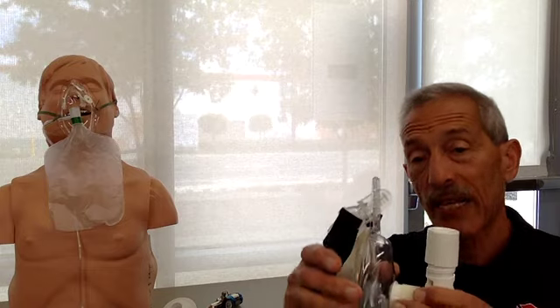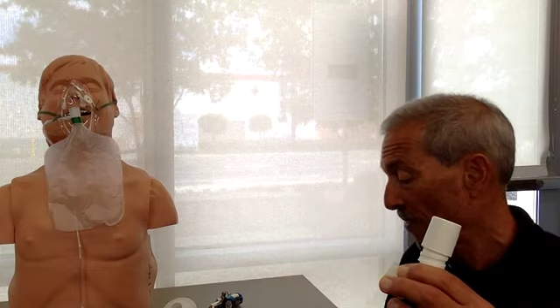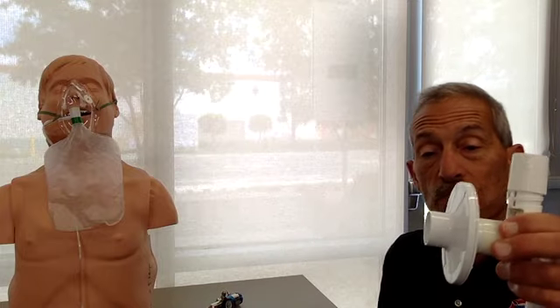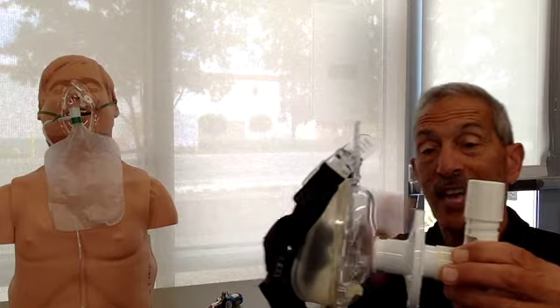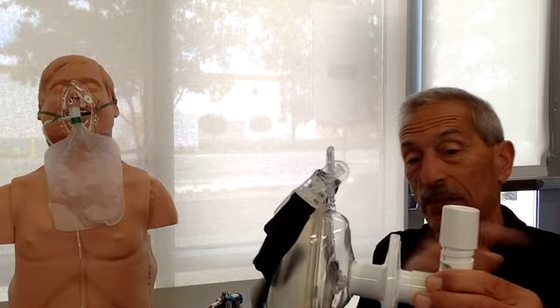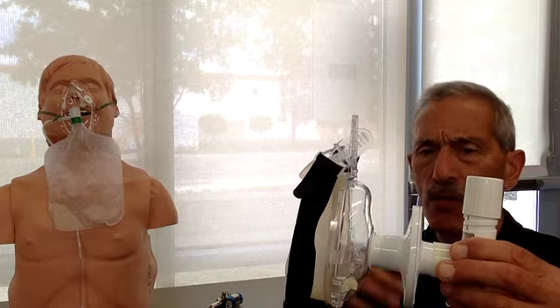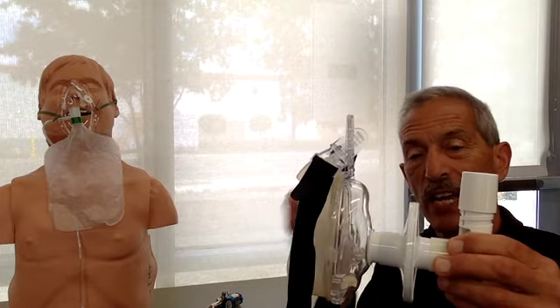The county would like us to add one more piece to our inline system, and that is going to be a HEPA filter. This HEPA filter basically just blocks out pathogens. So as this person's breathing out, it will trap the COVID or flu or pneumonia or whatever they might have. And this is what it would kind of look like.